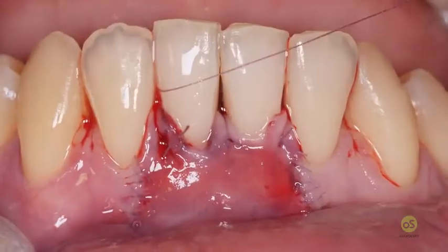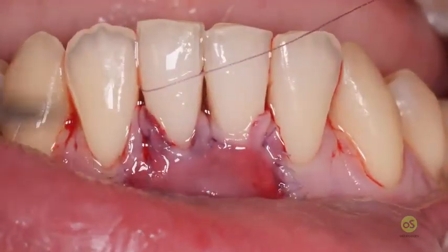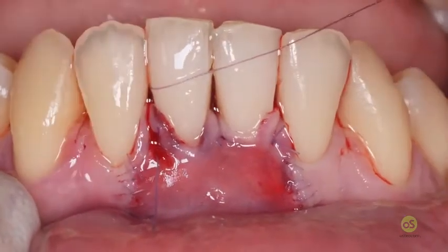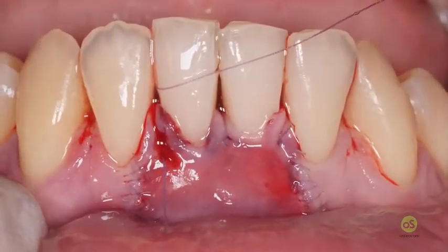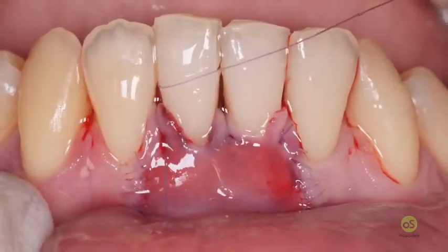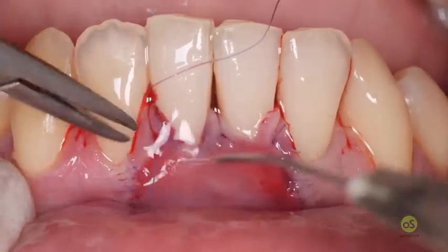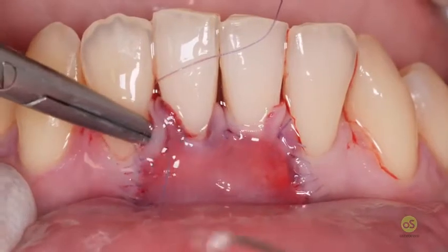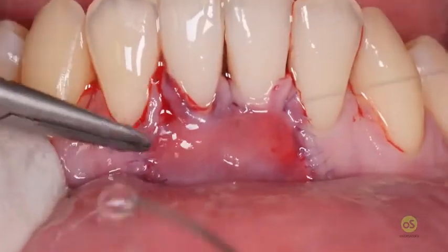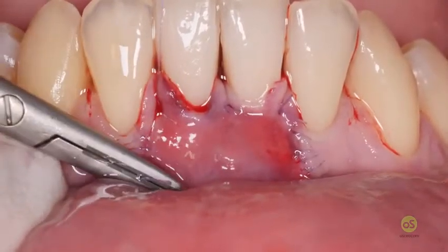Going back, and before closing, I cut here. I remove the previous surgical knot here, so I'm not traumatizing the papilla at all. I need saline so you can see that the papilla is perfectly healthy in the middle. And now I'm closing. I don't want to destabilize it because it's already very, very stable. But now I close with no tension.